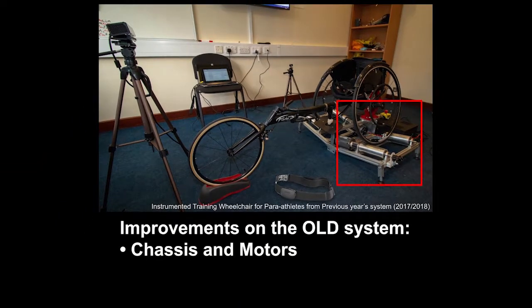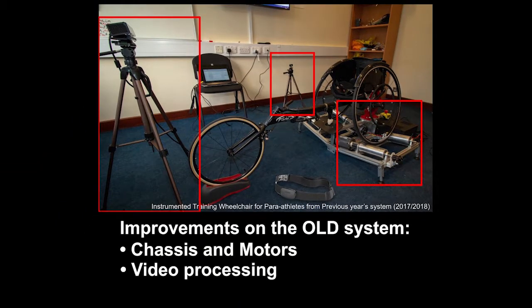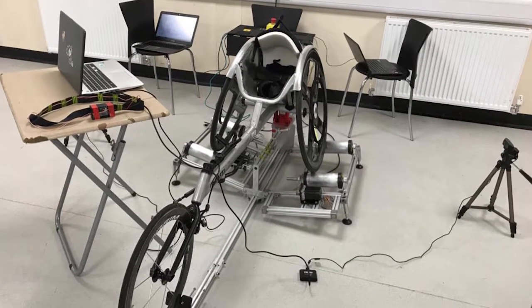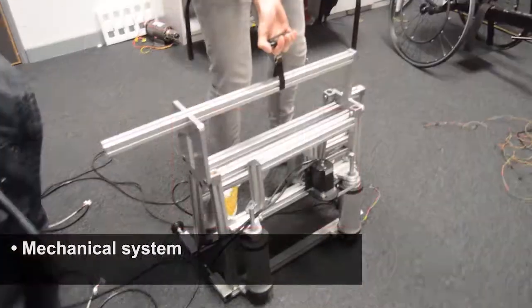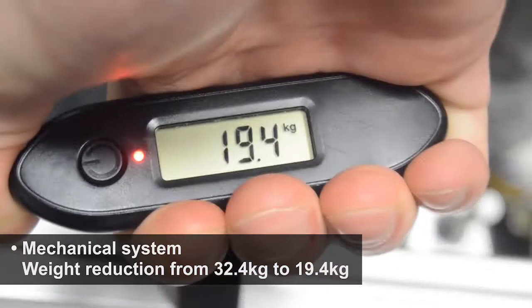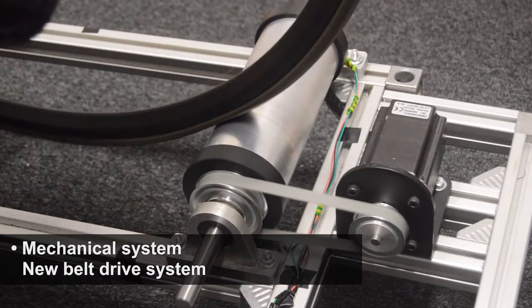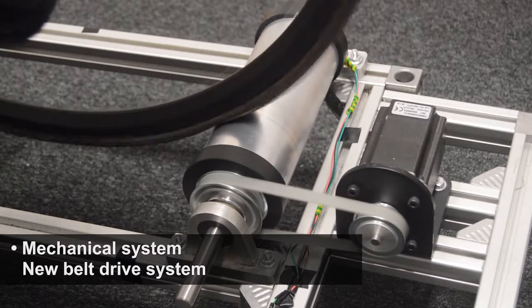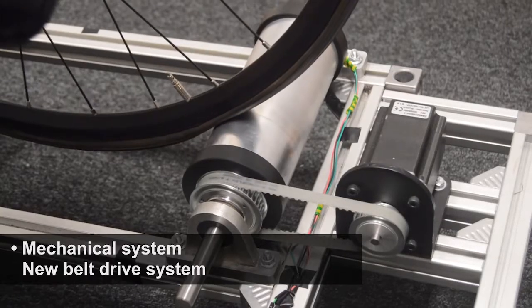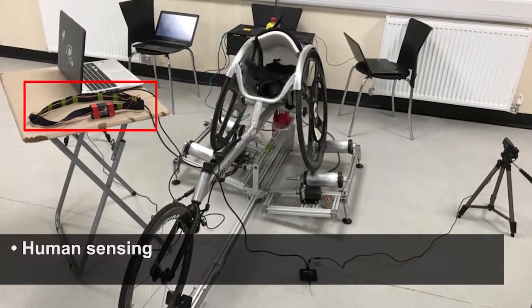Improvements have been made on the chassis and motors, video processing, and human sensing of the old system. Our new system has four main aspects with significant milestones. The first is the mechanical system, which delivers a 40% weight reduction by replacing the motors and removing the hydraulic jack. A new belt drive system for the motors is implemented, allowing the rollers to be freewheeling and achieving better torque scaling and torque transfer.